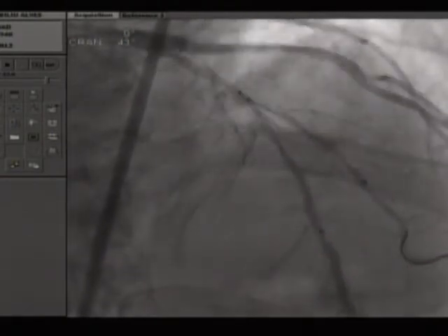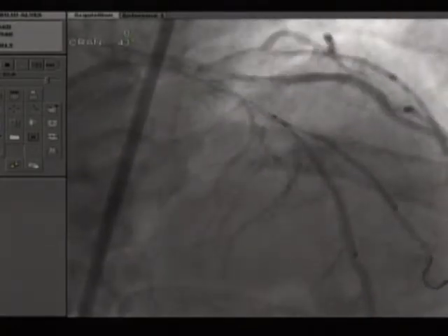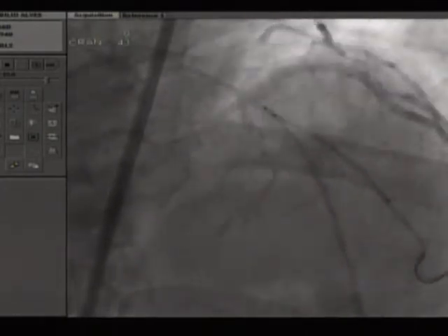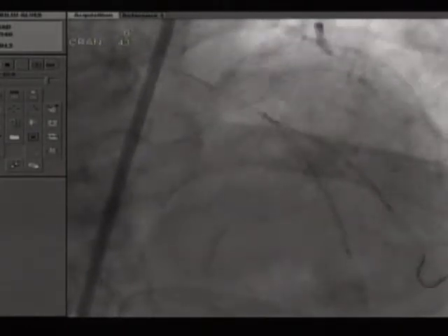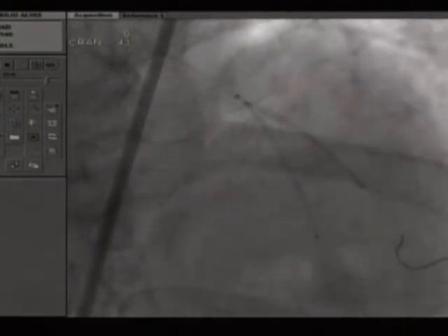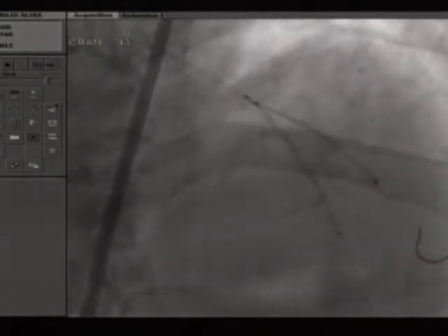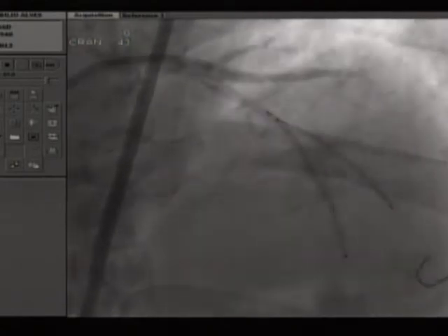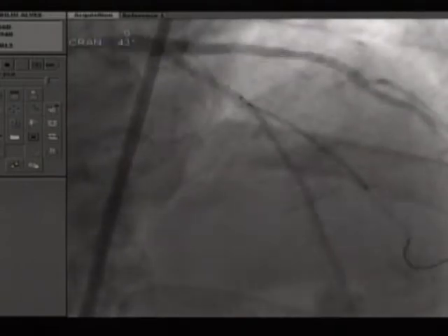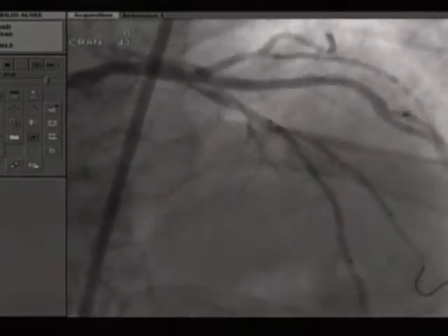First of all, thank you for the comments and suggestions. Thank you, Eberhard. I think IVUS here could be a good option. We have planned to perform IVUS afterward. We used Inspire 3.0 x 38 in the LAD and Inspire 2.5 x 28 in the diagonal. Both stents had very nice crossability and navigability. Then we have the stent in the LAD a little bit higher, and just a little mini crush in the diagonal. I fully agree with Miguel. It's not a big vessel proximally, so I'd like to avoid too many stents in the proximal LAD.